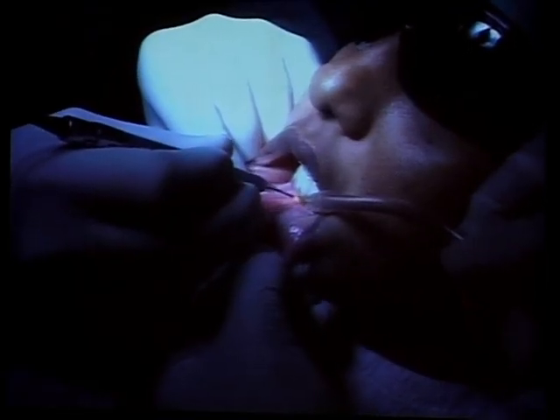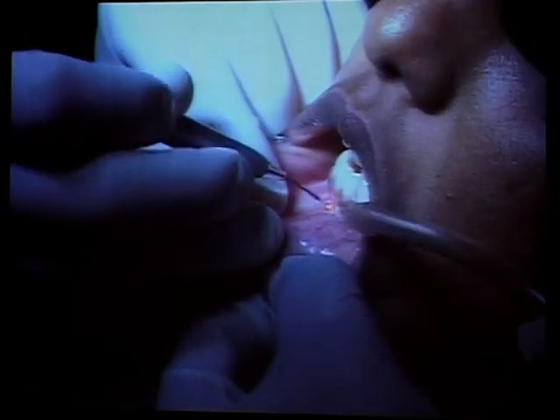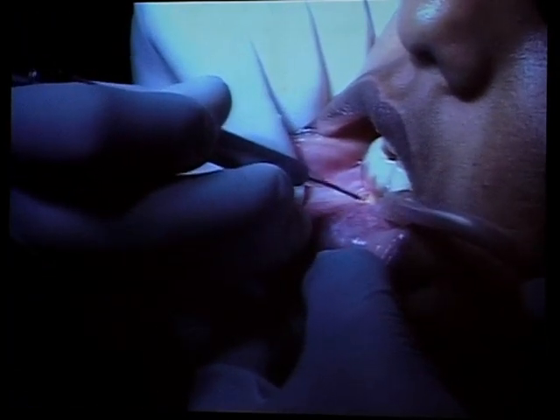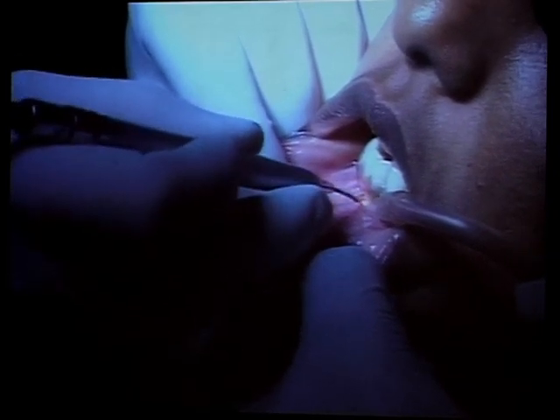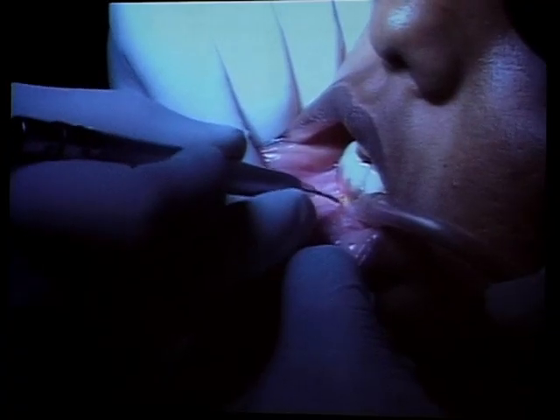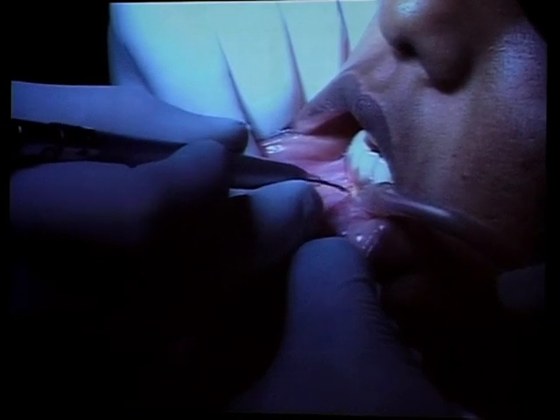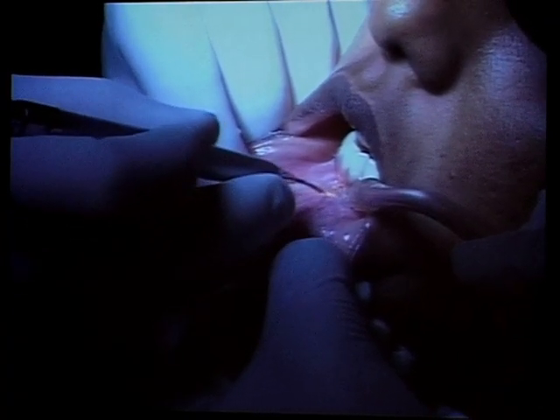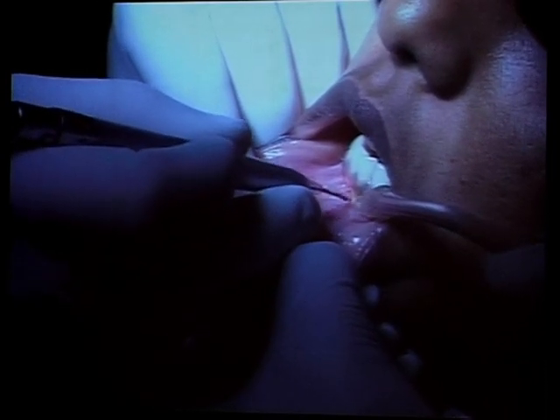Now you start lasering, and you can hear it. Okay, there must be more tension on it. And you always have to move the fiber. If you are stopping, you directly get carbonization. And you always create a rhomboid shape.